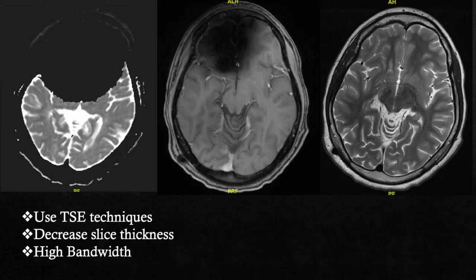So here we have an example. This is the same patient, but just different slices and the different effects that the braces have on each of these sequences. So the first image you have here on the left is an example of an ADC, part of the diffusion scan. And then we have a gradient echo in the middle and a T2 just on the right at the end. So susceptibility artifacts are the worst with long echo times. So what we'd have with the diffusion and also the middle gradient base scan.